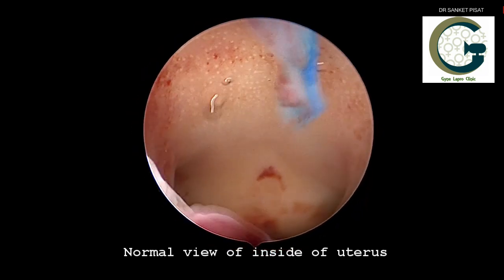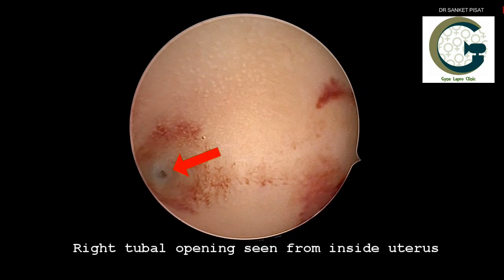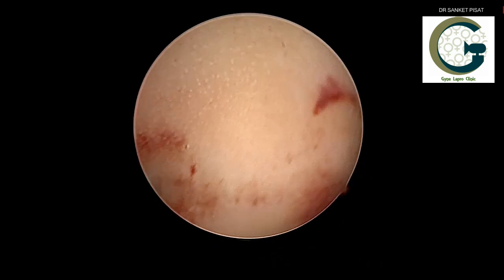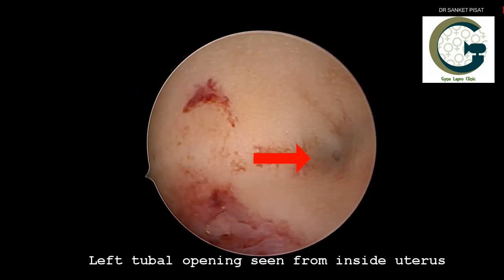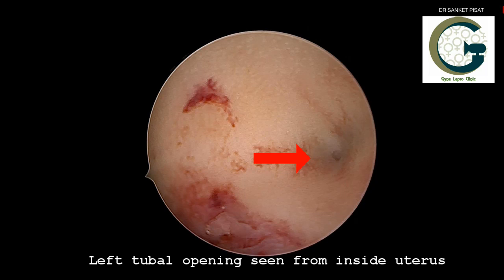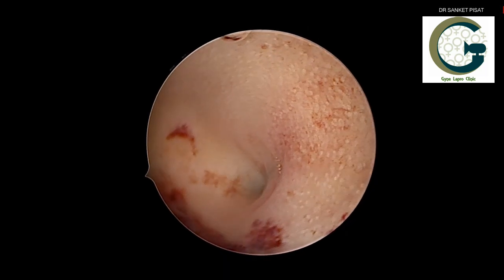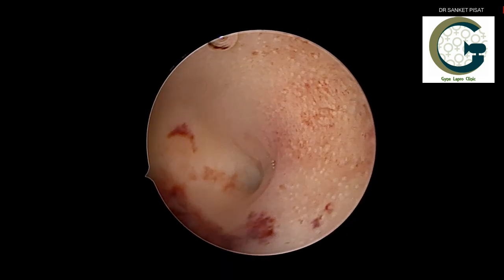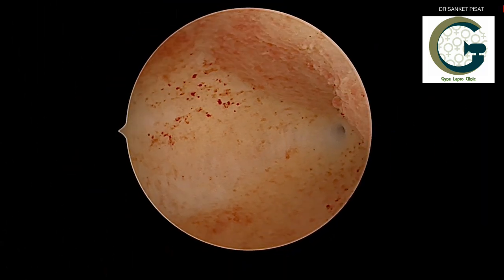This is the normal view of the inside of the uterus, which is a spacious cavity. You can see the right tubal opening which is seen from inside the uterus, and a mirror image of this which is the left tubal opening also seen from inside the uterus. The endometrial lining is normally smooth and does not have any localized outgrowths.